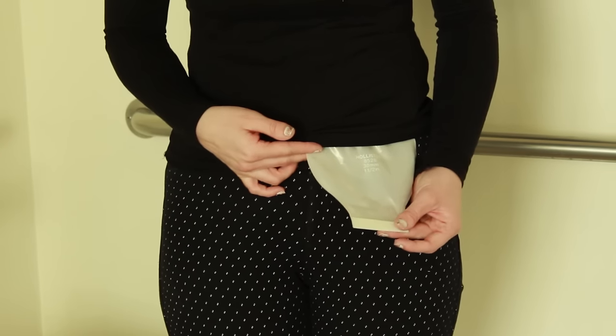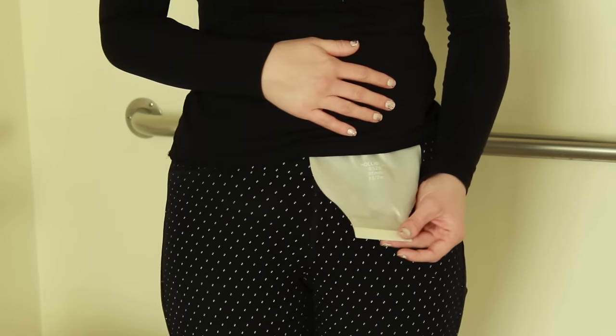I generally empty my ileostomy bag when it's about a third to a half full, and I do it about six to eight times a day. But how many times you need to empty your ostomy bag depends on what type of ostomy you have and also what you eat and drink in a day.